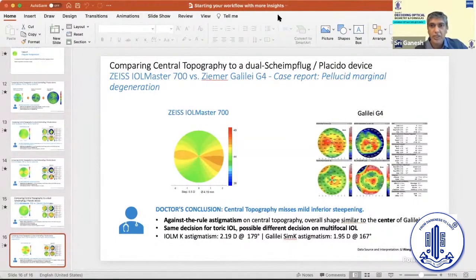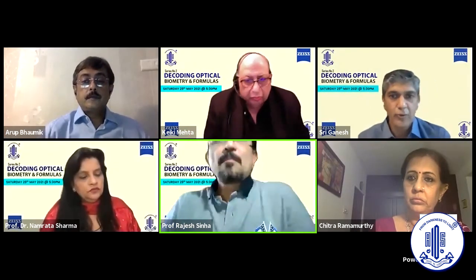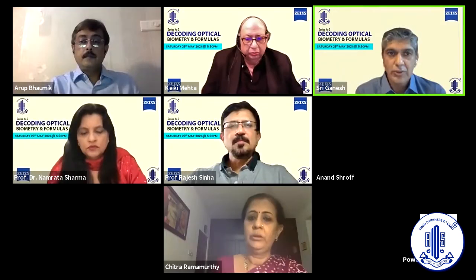Let me stop sharing this. So this is the new development in the IOLMASTER 700, where you get corneal topography, which is very useful for post-refractive surgery and also to decide about premium IOLs. So with that, I would like to end my talk, and thank you very much for your attention.